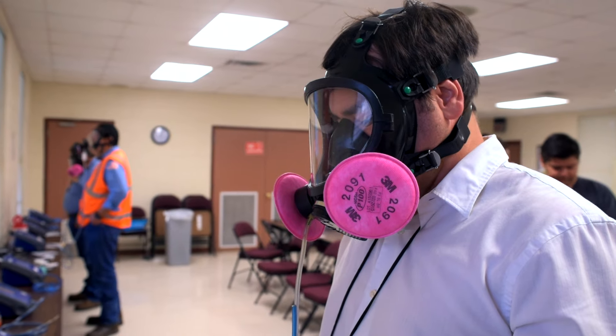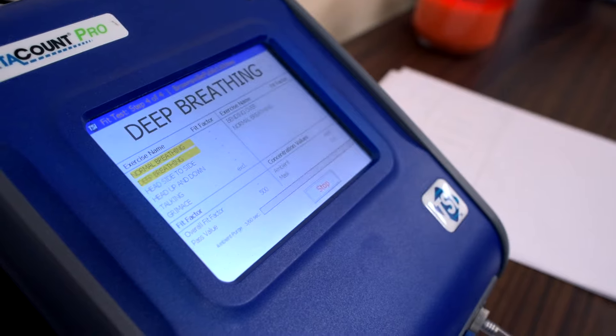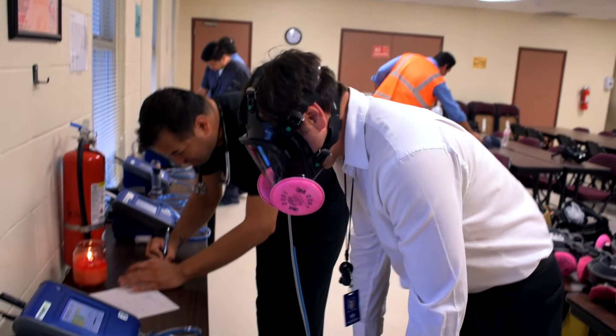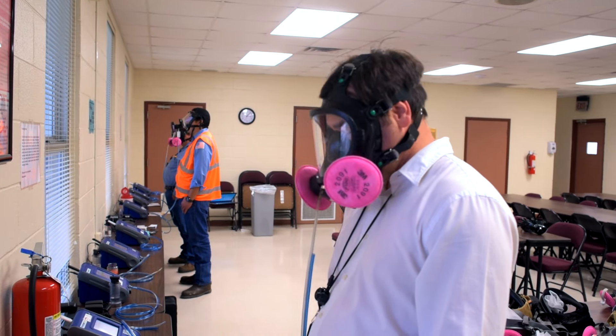The person being tested will then be instructed to do different actions, like breathe normally, breathe heavy, shake your head, bend over, and so on. During these actions, the machine is testing for a proper seal.